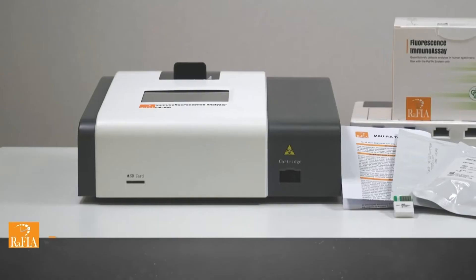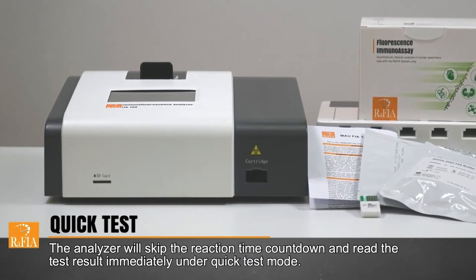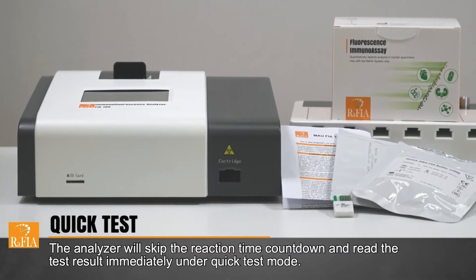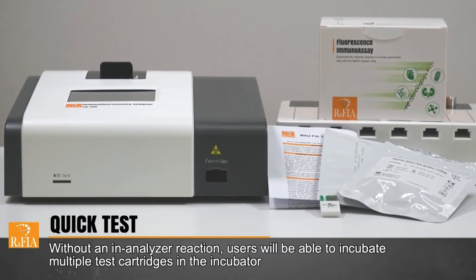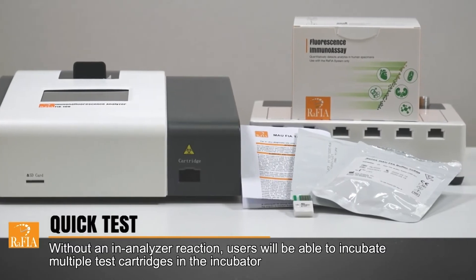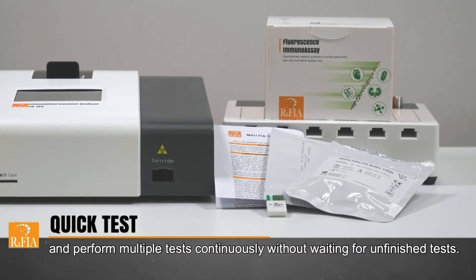The quick test mode allows users to perform test reactions outside the analyzer. The analyzer will skip the reaction time countdown and read the test result immediately under the quick test mode. Without an in-analyzer reaction, users will be able to incubate multiple test cartridges in the incubator and perform multiple tests continuously without waiting for unfinished tests.